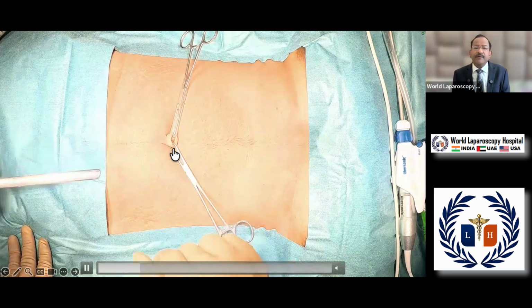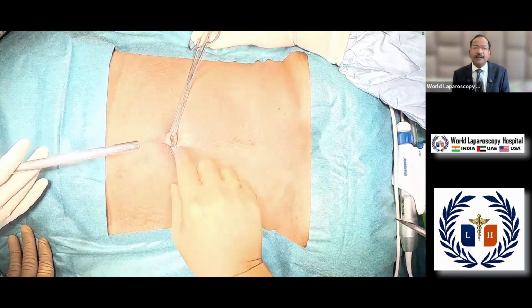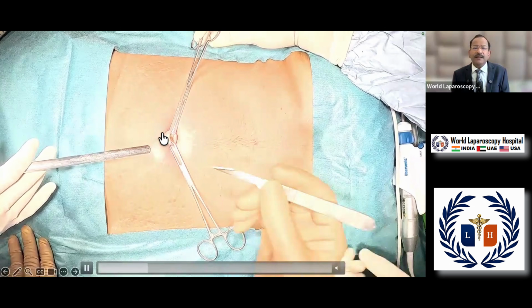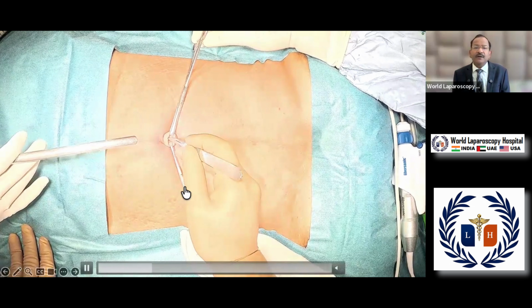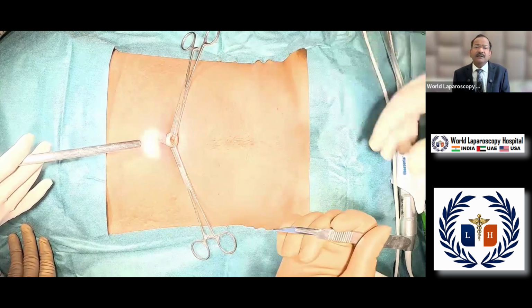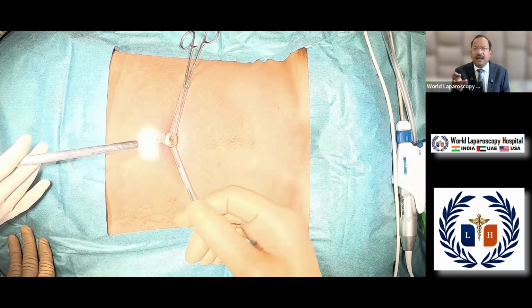After that, you take a 11 number knife and give one small stab wound over the inferior crease of umbilicus. So, this is giving a stab wound, only 2 millimeter stab wound, that is all. Do not give initially 10 mm, otherwise half of the gas will leak out and you will not have any advantage of quadromanometric indicator of the insufflator.